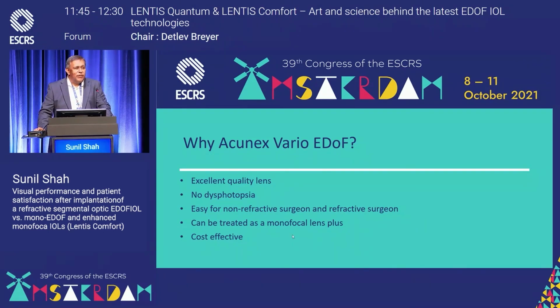Rather than treating it as a monofocal plus, I mean, it is an EDOF lens, but it is a significantly better lens than your monofocal. But you can use it in just a similar way to your monofocal and not worry about it. There are no problems with using the lens. And of course, the cost is significantly better than a full multifocal.